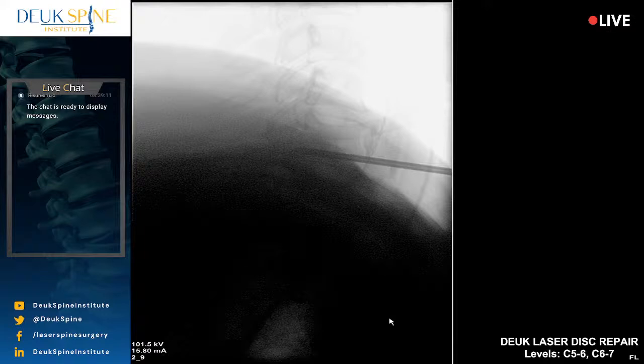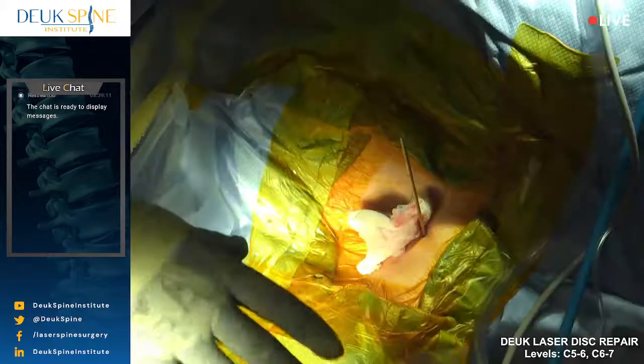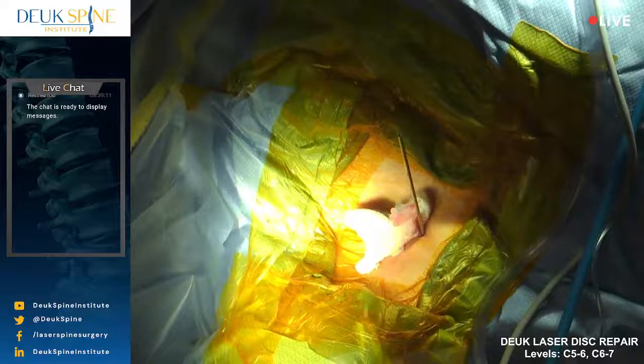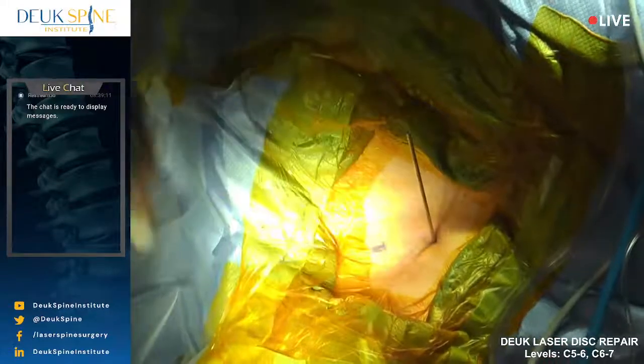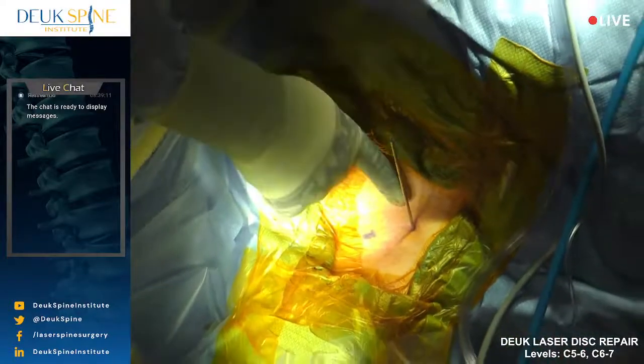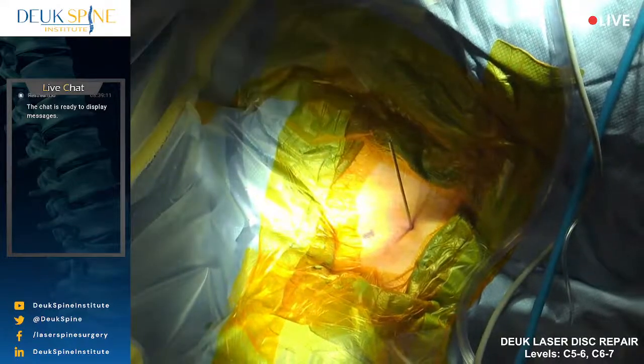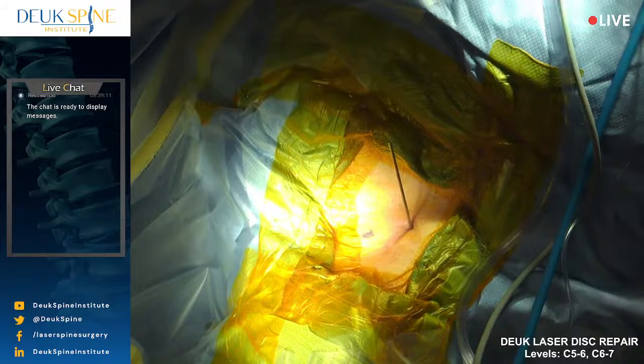So far, I want you all to understand this patient is sterilely prepped and draped. The surgery is a sterile surgery. It's done outpatient. We don't go to the hospital, but we also don't want an infection. So we do sterile prep and drape like a real surgery. We've made a 4mm incision in the front of the neck on the left side because we're targeting mainly right arm symptoms. I always like to go on the opposite side.